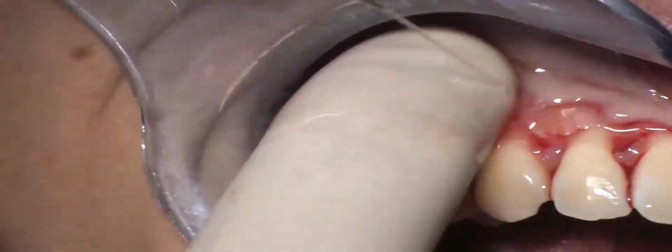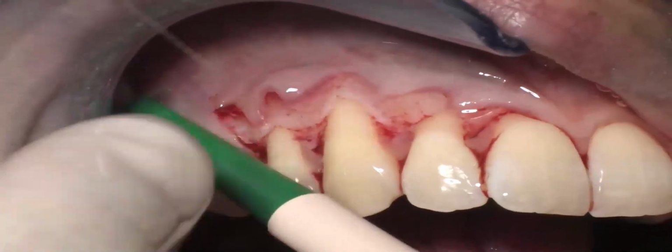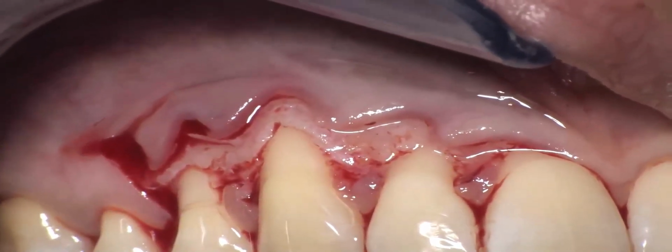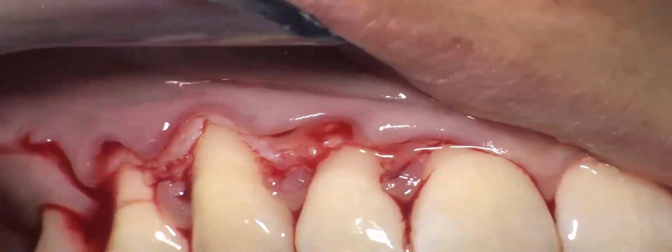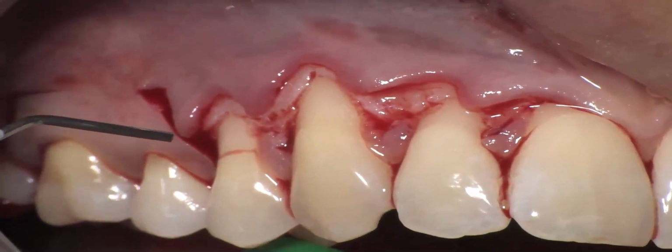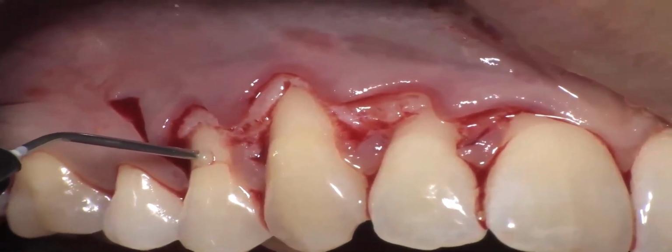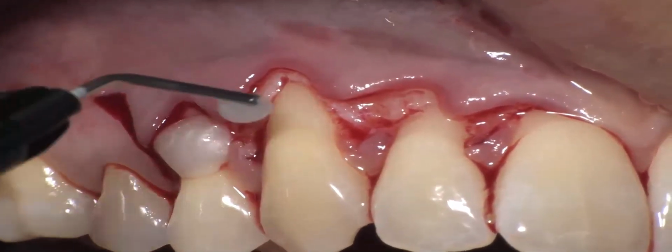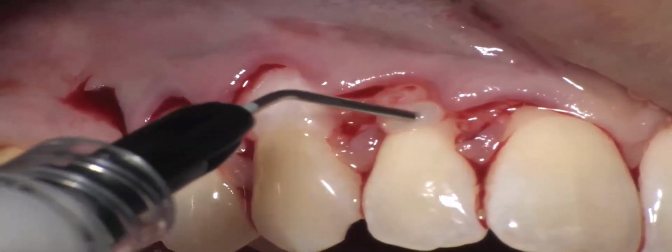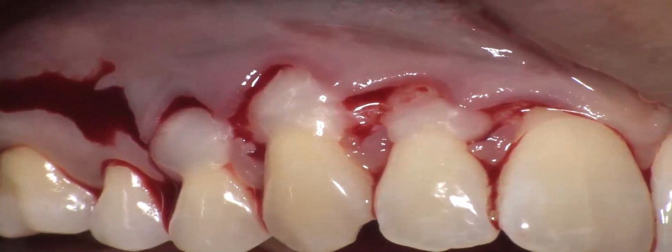You see that now bleeding is completely under control despite very, very thin tissue. There is a really very clean surface onto which we are applying our EDTA gel in order to improve blood adhesion to the dentin tubuli.